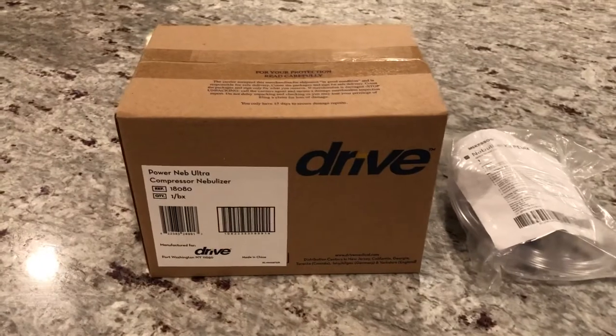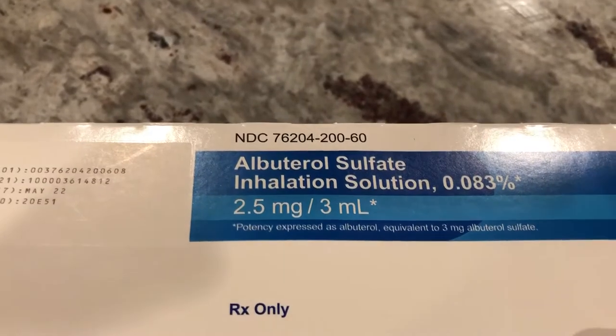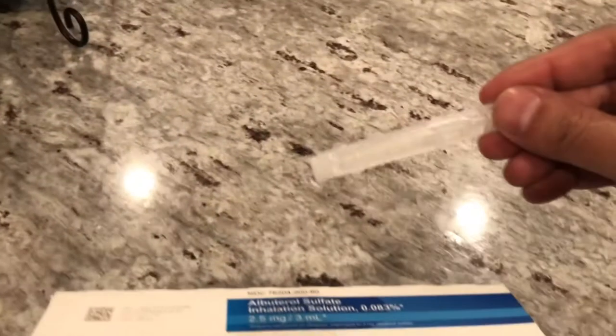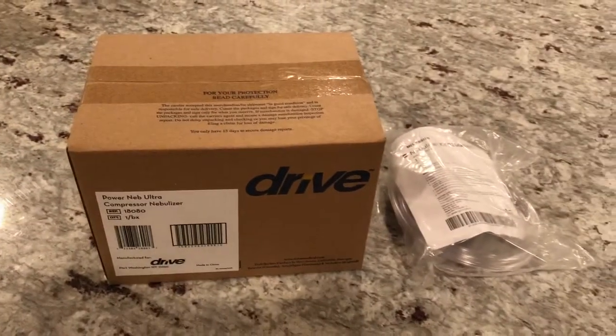His doctor prescribed him albuterol, but it has to be administered via this nebulizer — this is a Drive PowerNeb Ultra. The dosage is 2.5 milligrams per 3 ml, so he's got to use one of these pre-dispensed vials every six hours as needed. I'm gonna go through a quick unboxing and see how this thing works.